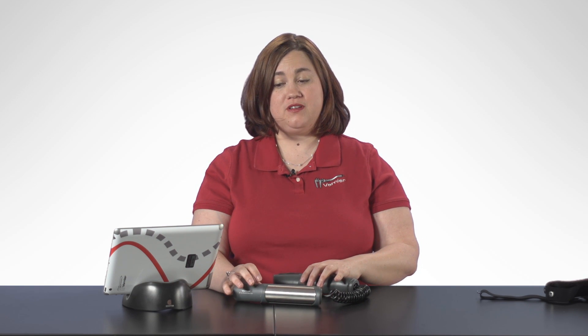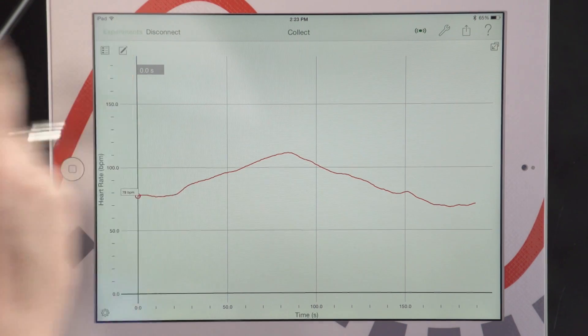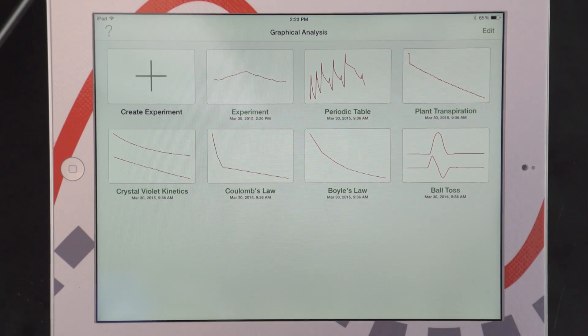What's nice is that once I let go of the grips, they will actually turn off and disconnect, saving some of the battery life on our Go Wireless Heart Rate. The other nice thing is I can go to experiments now, and my experiment has automatically been saved in Graphical Analysis, so you don't have to worry about losing any of your data.